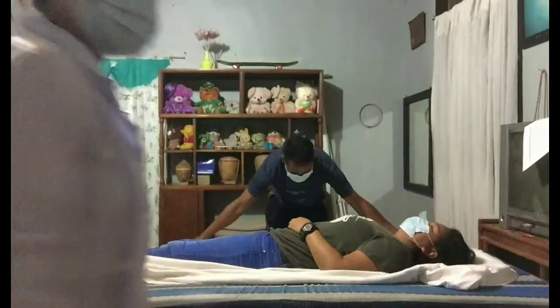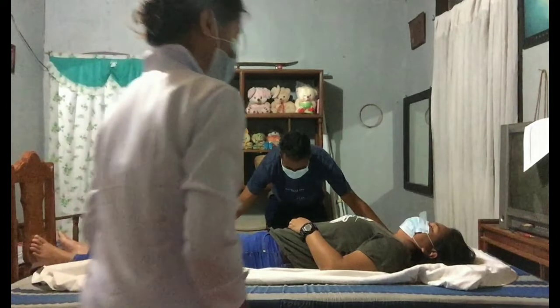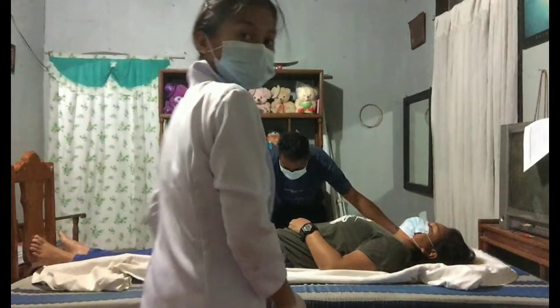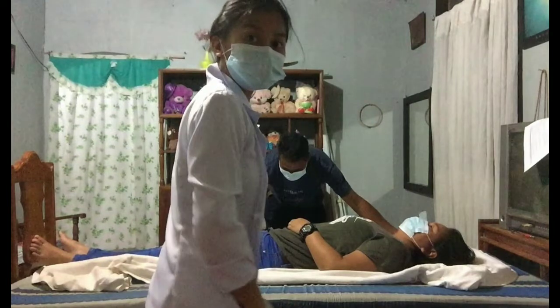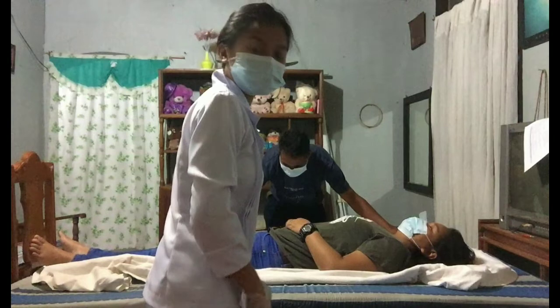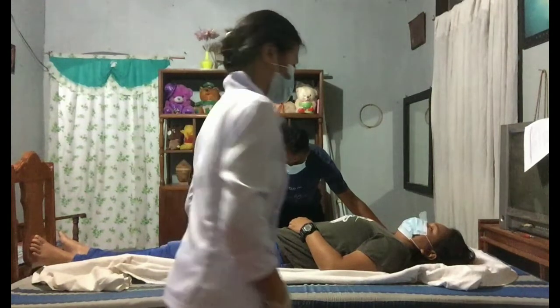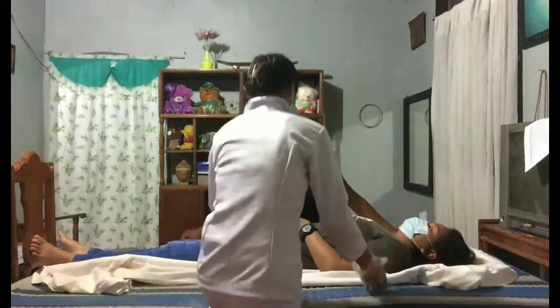The first step in transferring a client from bed to stretcher is to adjust the head of the bed to the flat position or as low as the client can tolerate, and raise the bed to a height one-half inch higher than the transport stretcher. Lower the side rails if in place. Loosen the draw sheet or place a lifter under the client, roll the sheet close to the client's body, and position the stretcher next to and parallel to the bed.